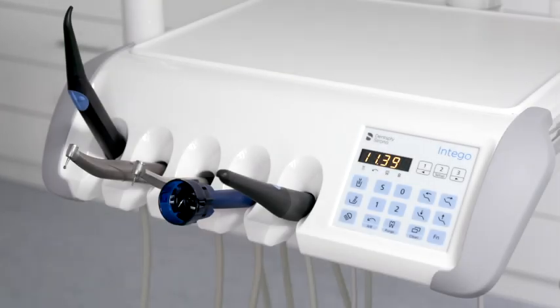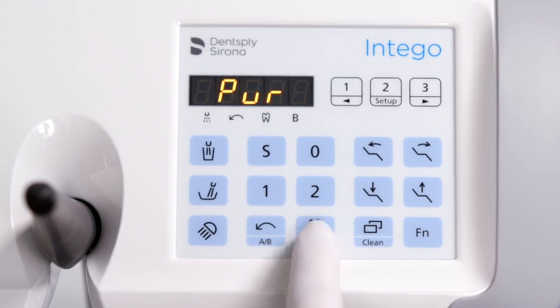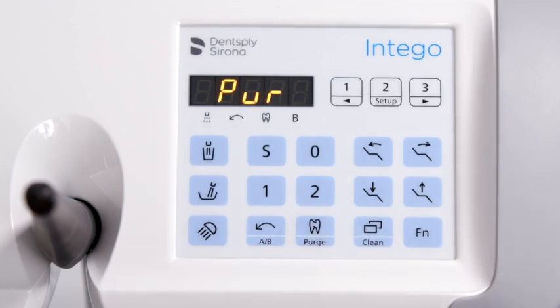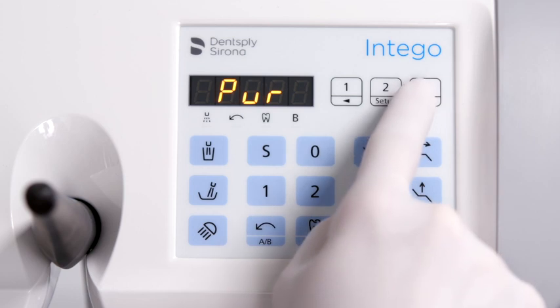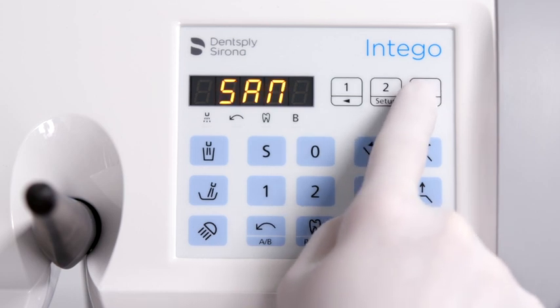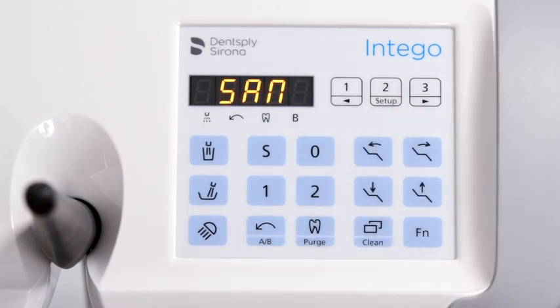Sanitize the treatment center at least every four weeks or after an extended period of non-use. With all instruments placed in their holder, press the purge key to open the hygiene programs. Press the right favorite key until the sanitization program is visualized. Start sanitization by pressing the favorite button 2.